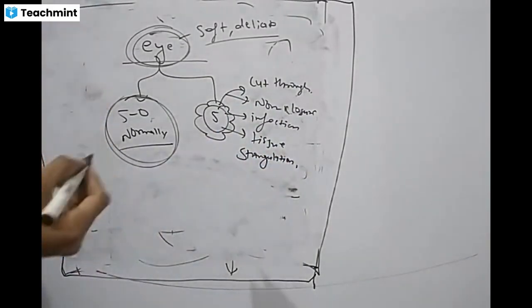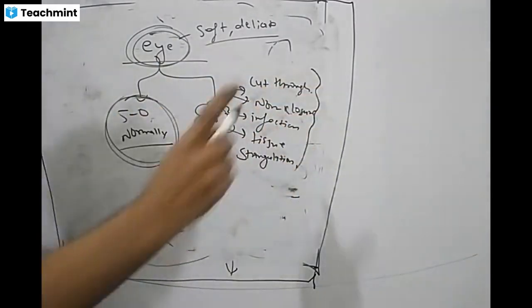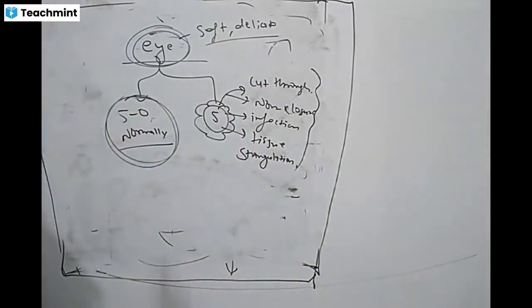So these are the complications if you do not match the size of your suture with the tissue.